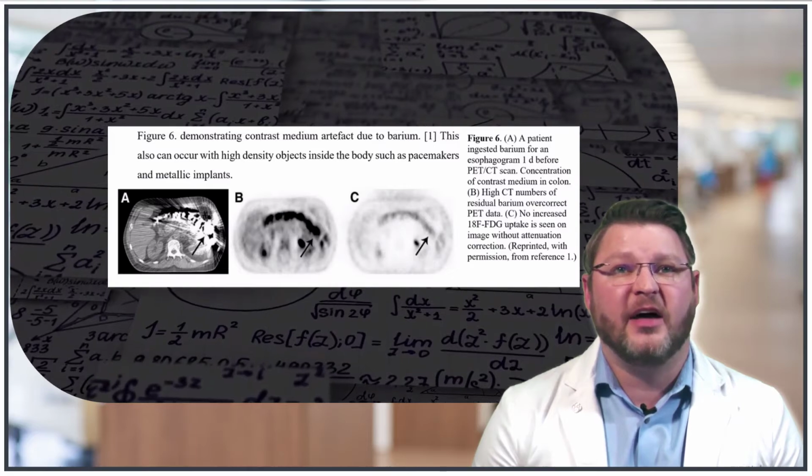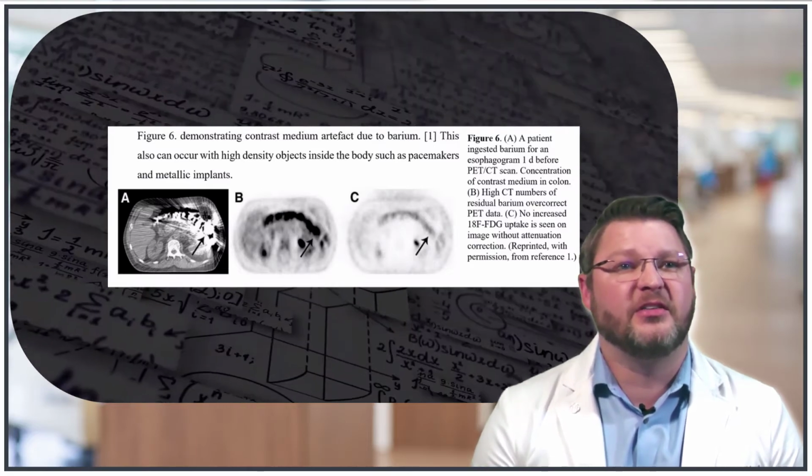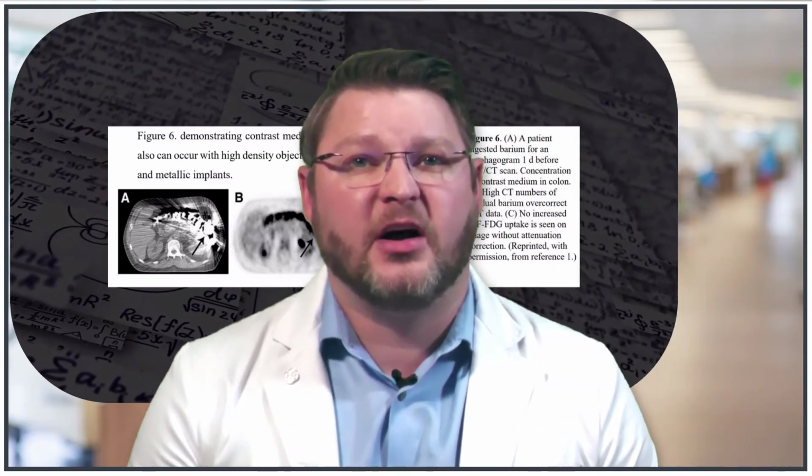Ways to prevent artifact are to avoid the use of contrast during the exam or after a contrasted exam. Perform a CT with and then without contrast media. Increased radiation exposure should be evaluated to see if the benefits outweigh the risk. Technical novelties that may help are the use of metal subtraction software that has been shown to reduce artifact caused by high-density contrast media in PET-CT imaging.